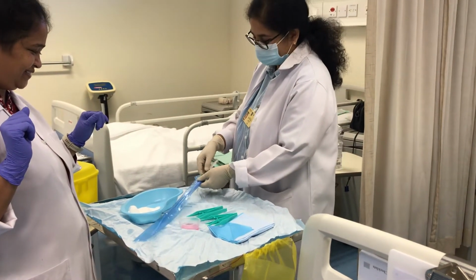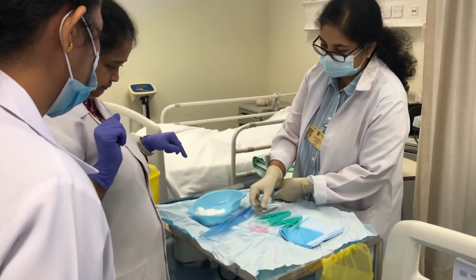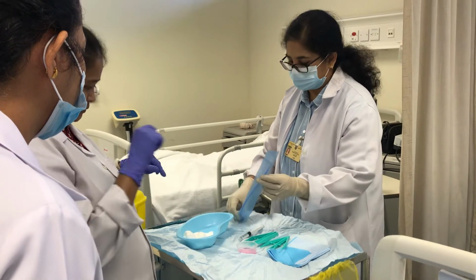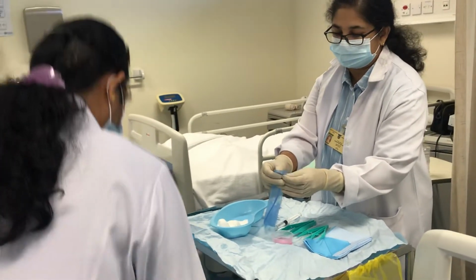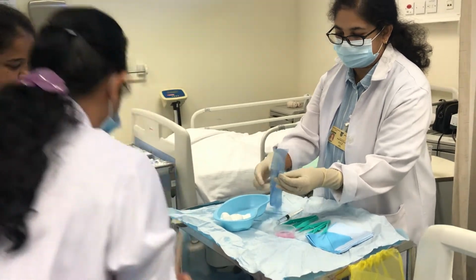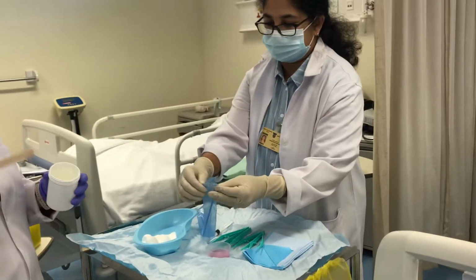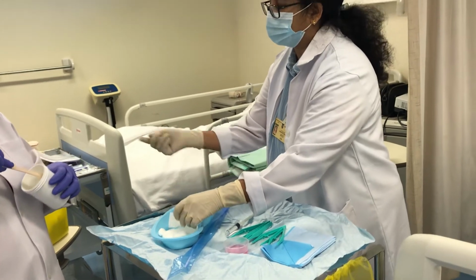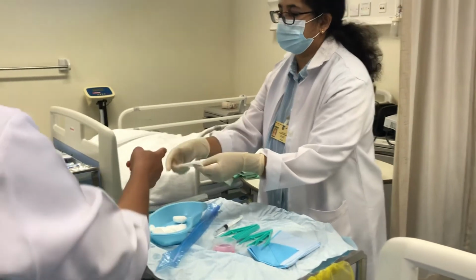I'll remove it now and keep it to the side. Now we need to prepare this also with the jelly. So I'll open the side. We are not supposed to use this, but we are using. So imagine it is sterile. It should be sterile actually. We cannot use this because we are taking all this care to do it in a sterile way. Can I have that extra one so that I can cross this one?